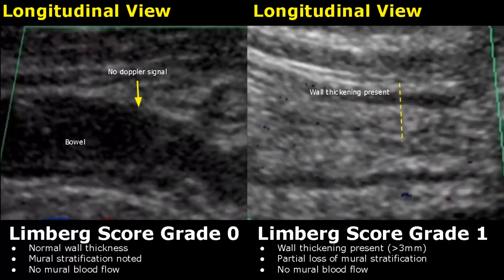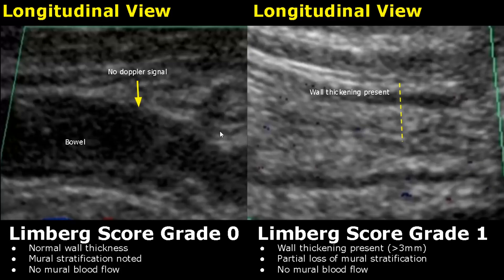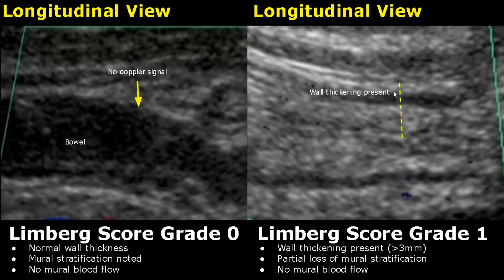The Limburg score is used to assess bowel vascularity with the help of Doppler ultrasound. Grade 0 is given to a normal healthy bowel — there is normal wall thickness, we can identify the layers, and there is no blood flow seen within the wall on color Doppler. In grade 1, wall thickening will be present; due to this thickening there is partial loss of mural stratification, and no blood flow is found within the walls.